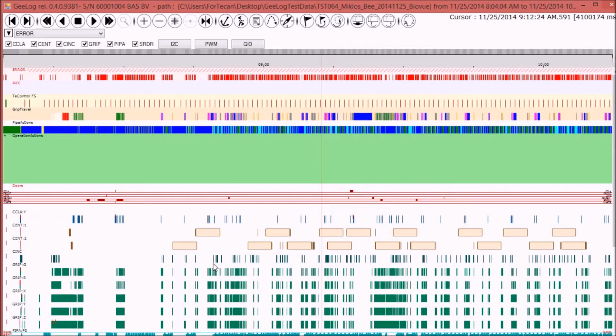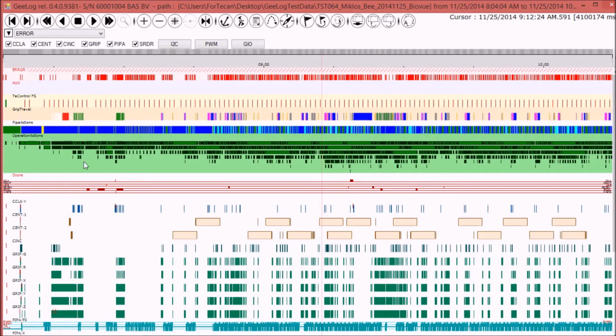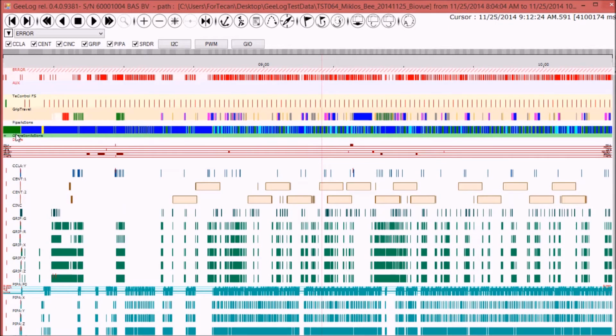This video wants to present and demonstrate a package that I wrote in C# for representing and studying the log files produced by a medical robot. This device is composed by up to 25 motors in one of its versions that drive 2 robotic arms and a number of other subsystems. This package loads as an input data all the log files that have been produced during a real session.